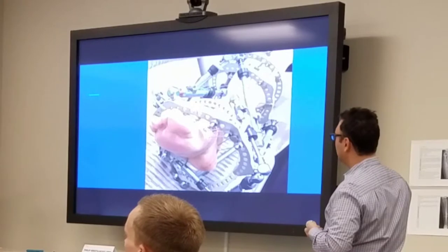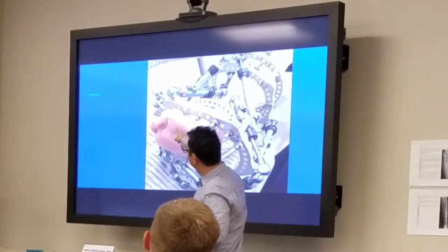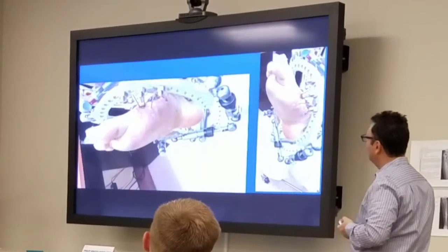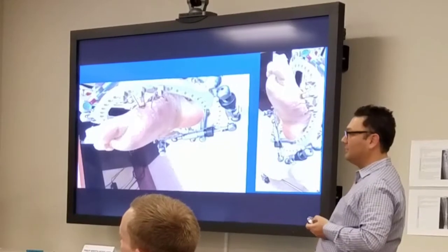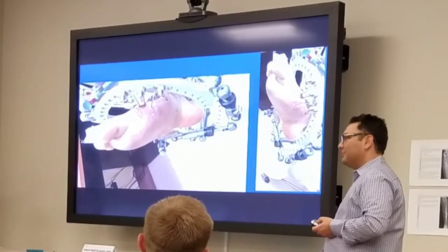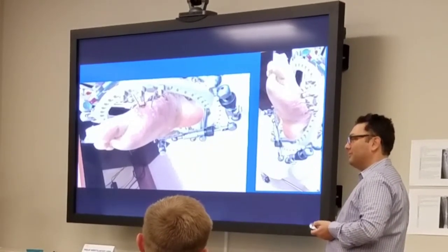So I noticed there aren't any zip ties anywhere on the screen. I see one over there, the top corner. They're clear. And the top, clear. Got it. Yeah. And with so many other frames, you have them all the way around. Is there a reason? Do you have an experience or something that led to that? Some of them we just predicted quicker, or some of them we just got lazy.